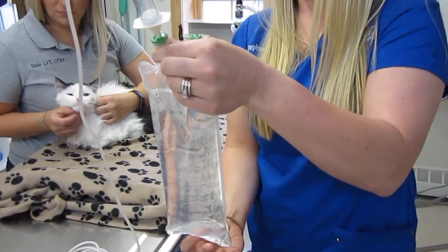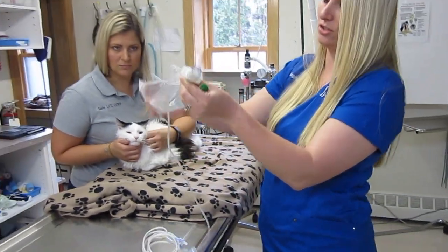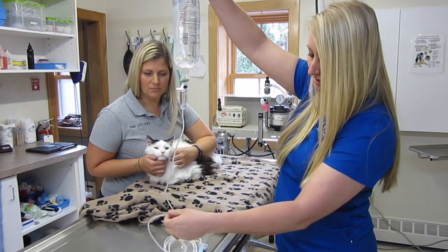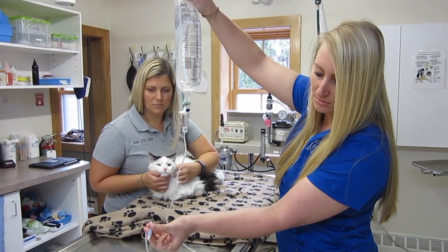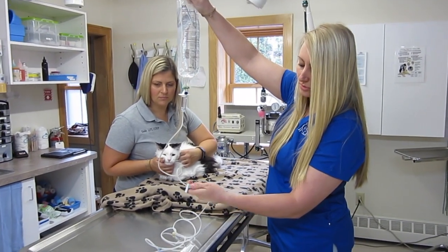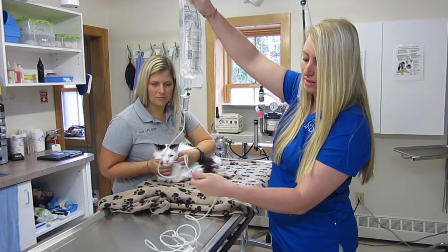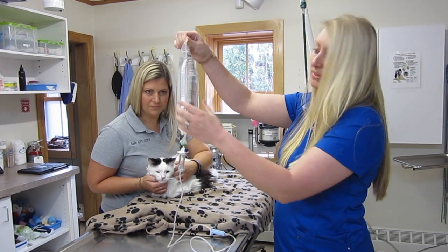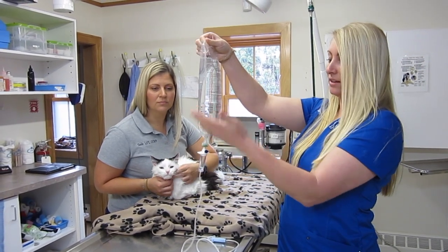And then what you want to do is what we call bleed the line. So you'll actually turn the bag upside down and allow the fluid to run all the way through the line until you don't see any air bubbles. And you will see some of the fluid running out, which is okay. Once all the bubbles are gone, you're going to take this white scroll and scroll that all the way down so that it clamps off the line. And basically your bag is ready to go.